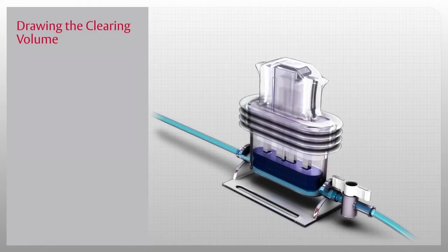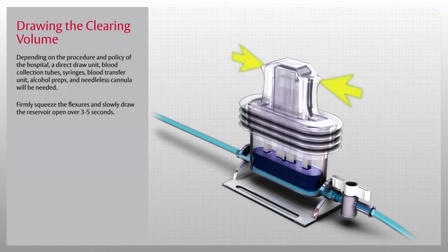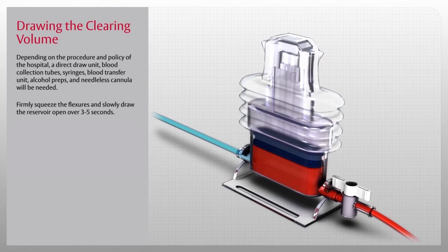Once the system is primed, you are ready to draw the clearing volume. Depending on the procedure and policy of the hospital, a direct draw unit, blood collection tubes, syringes, blood transfer unit, alcohol preps, and needleless cannula will be needed. Firmly squeeze the flexures and slowly draw the reservoir open over three to five seconds. Then close the shutoff valve by turning the handle perpendicular to the tubing to prevent aspiration of blood from the reservoir.